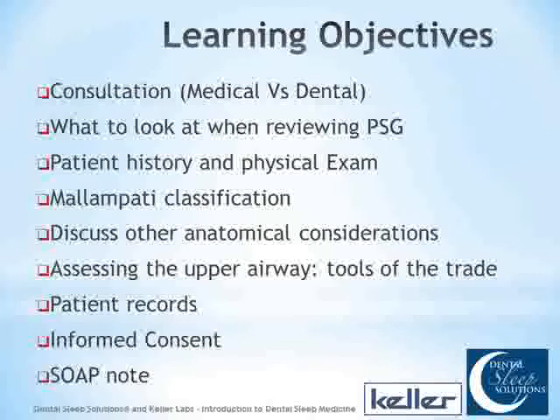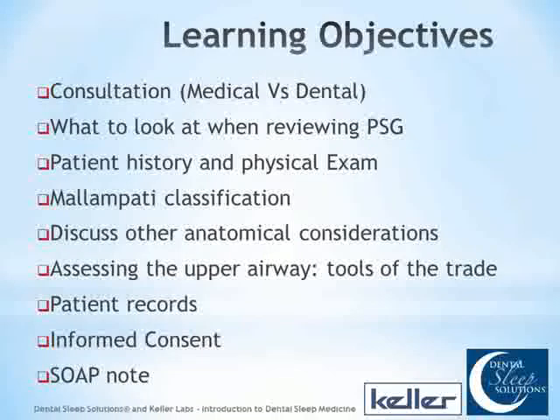When we look at a PSG, the polysomnogram, that's the sleep study, remember. What specifically are we looking at or looking for? They're all different, and sometimes the information is at the front, sometimes at the back.